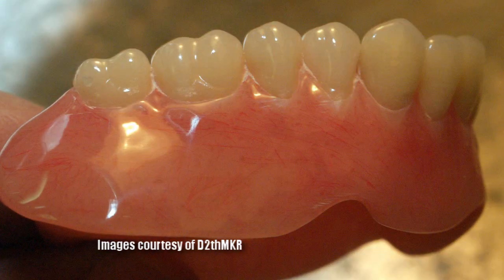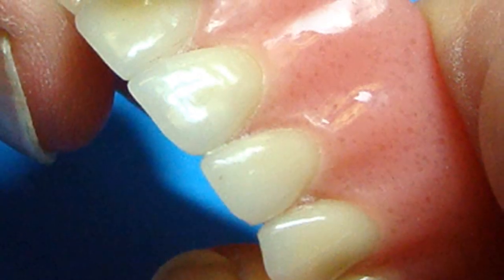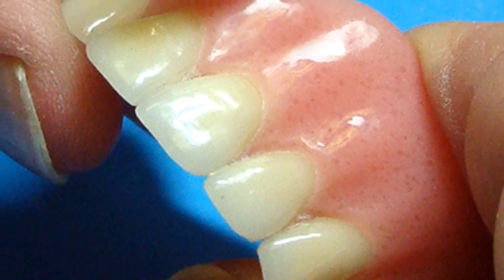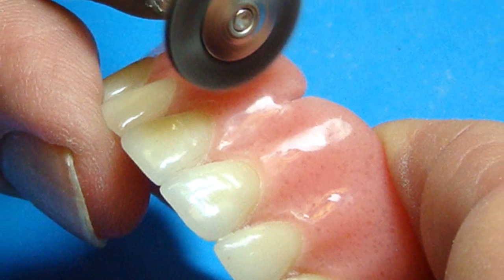From rough to shine in one quick operation. Another huge benefit of being able to work entirely in a dry environment is the ability to use small wheels for smoothing, finishing, and polishing.